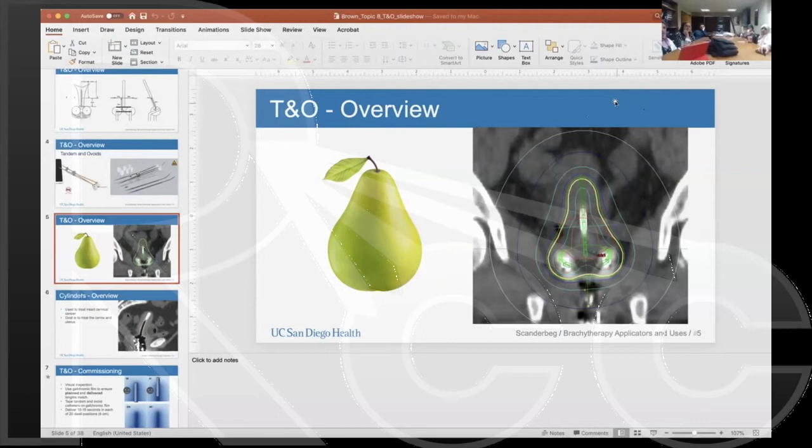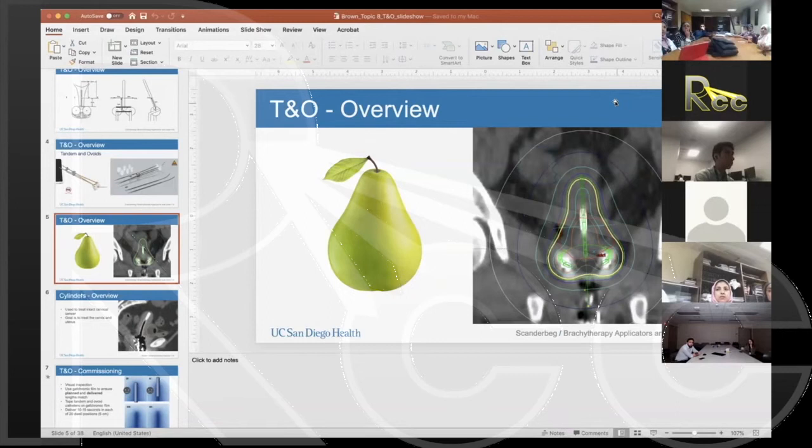So another question from Deepak. What should be the bladder, rectum, and bowel protocol for a better outcome? I think this question might be about dose tolerances. We have some fairly well-defined dose tolerances for bladder, rectum, and bowel. Most of those are the dose to the highest 2 cc volume for each of those organs. We have a spreadsheet that allows you to track that, including your external beam dose and the dose that each organ gets from each of the fractions. We will get to that later on, if not in this presentation, then definitely in John Eich's presentation in a few weeks.